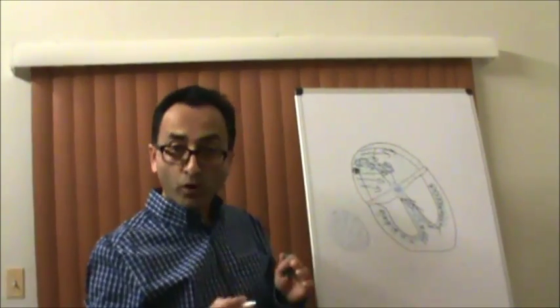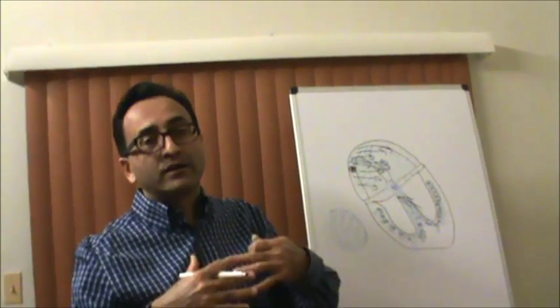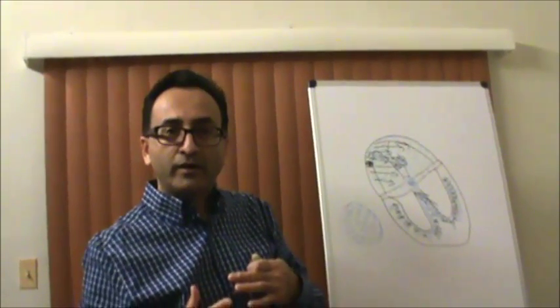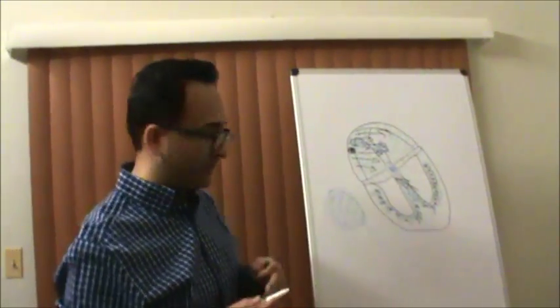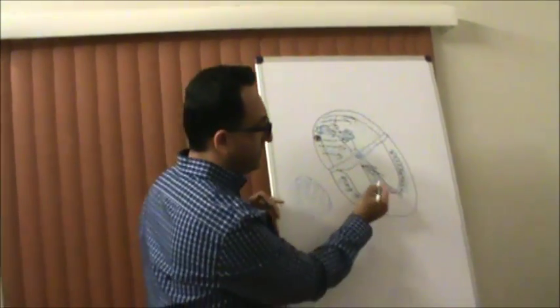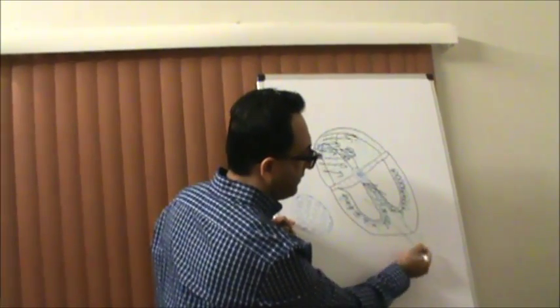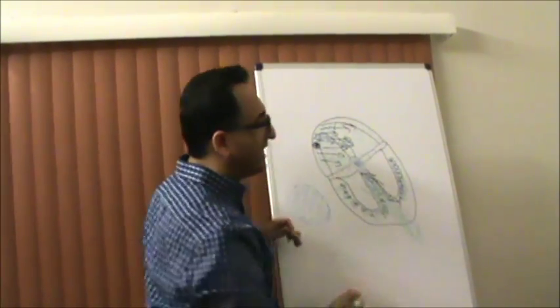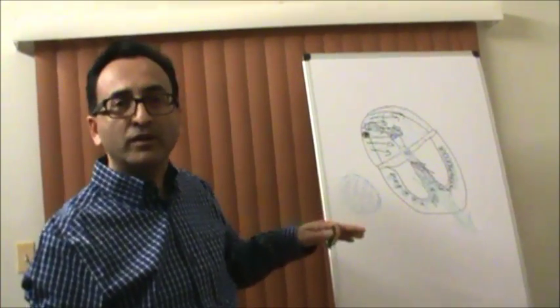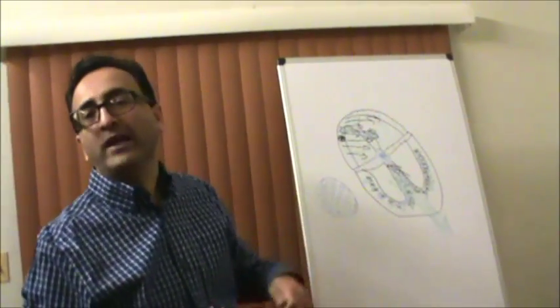So when simultaneous vectors are being generated, if we have to draw one overall, we can consolidate and have one single consolidated cardiac vector during this significant electrical event. So what do you think? How would it look like? So it goes like this. And why is that? Because the left ventricle is powerful, so it would dominate, and that's how the vector would be going that way.